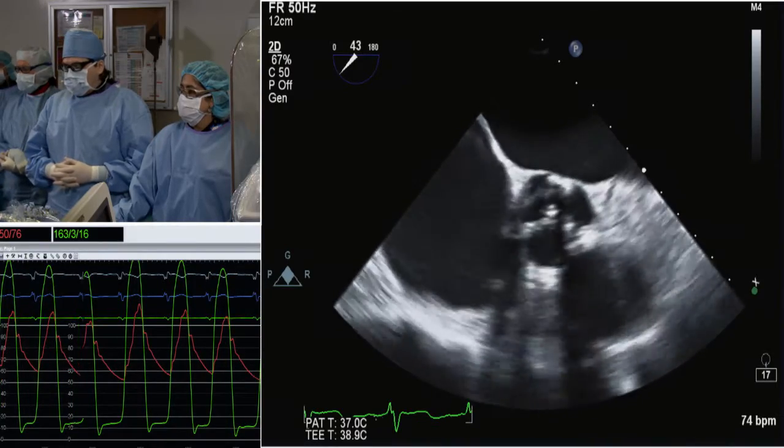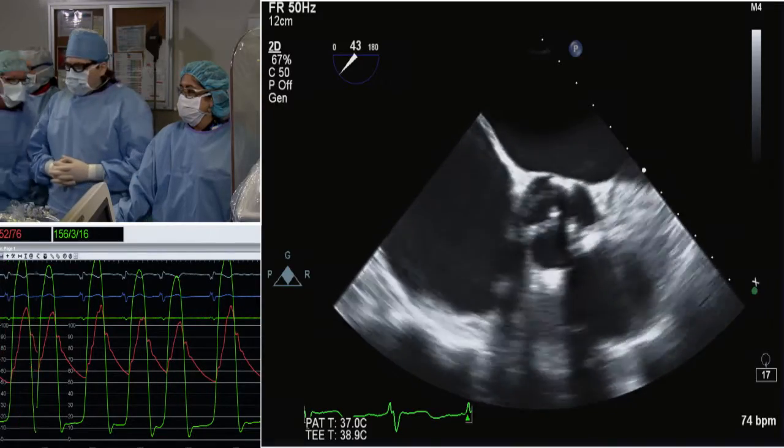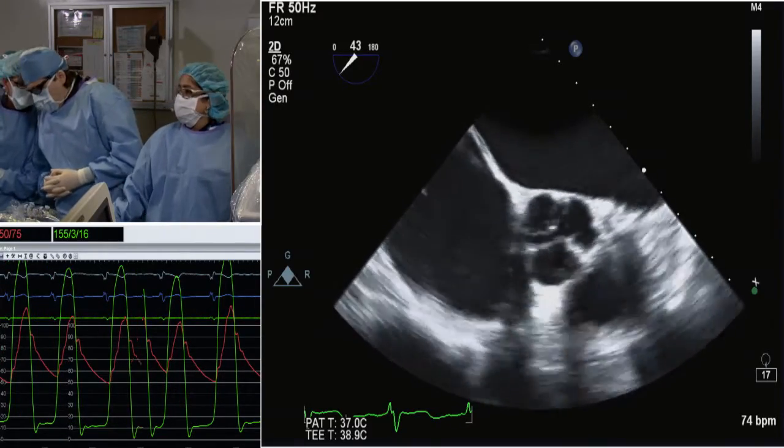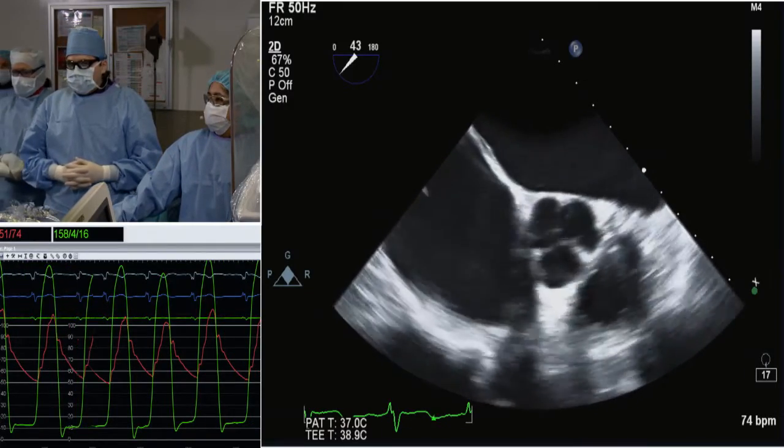And if you could prevent a post-dilatation, why not? And what would you predilate with? Would you go soft, or would you be a little bit more aggressive with your predilatation? So here the annulus measured 20 by 28. I'd probably go with a 20 balloon.